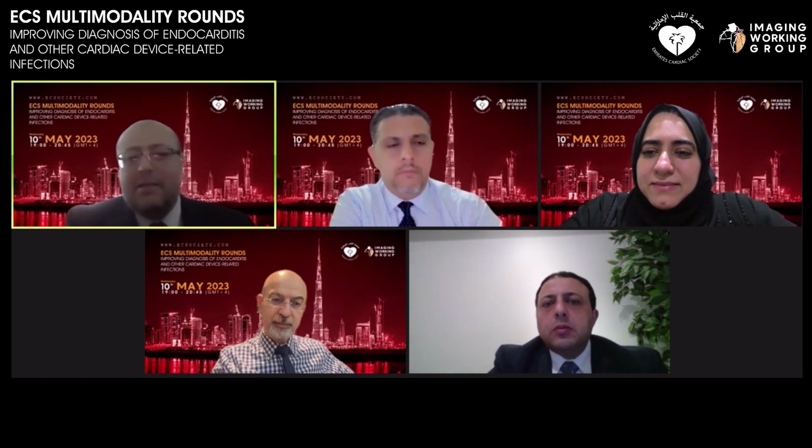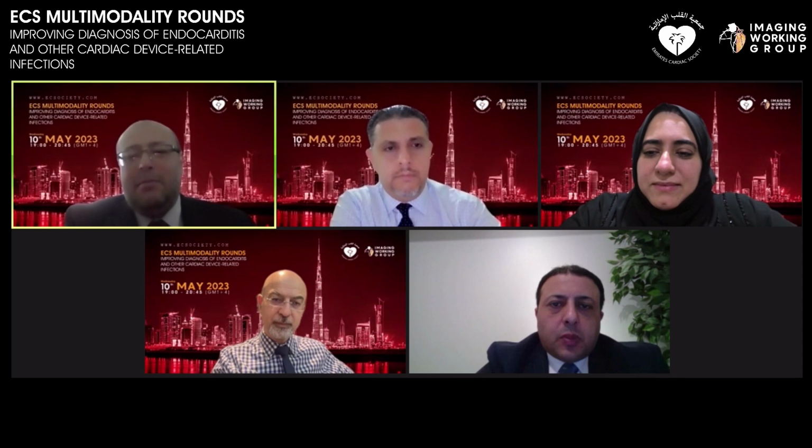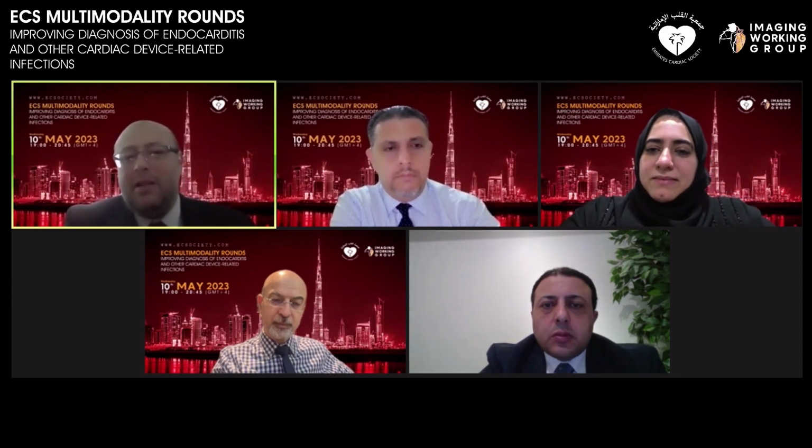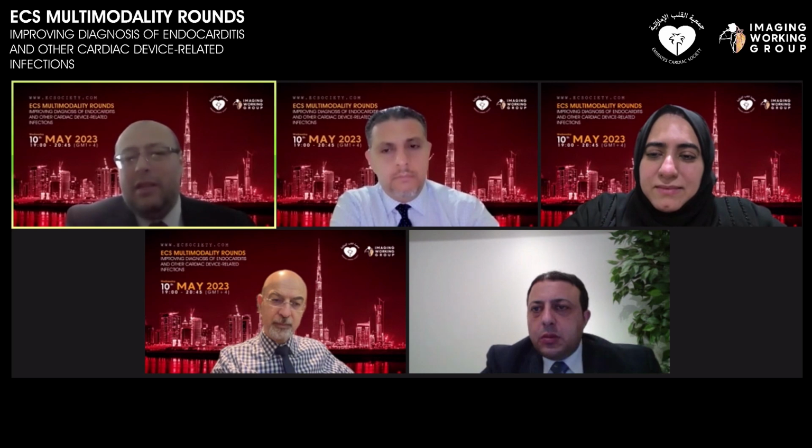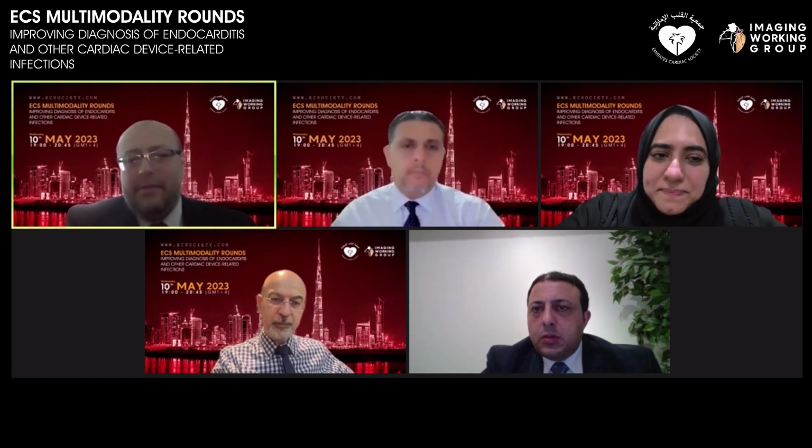So on the lead side, I like to look very well at the lungs, and FDG PET is going to be very helpful for these patients. Pure isolated lead infection, I remember very few cases, and most of the cases were pocket infection with some lead involvement. I remember one of them where we showed there was something in the lung, which made us very concerned about endocarditis in that case. Okay, wonderful, thank you.